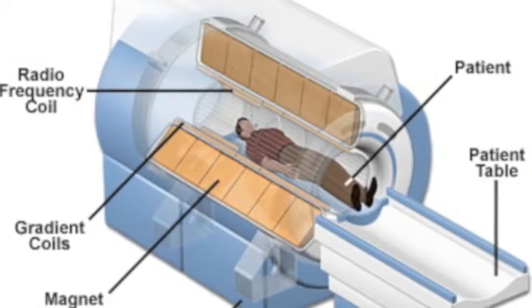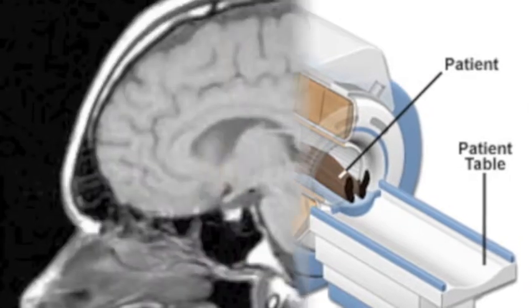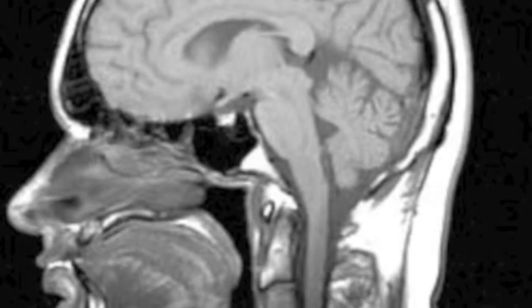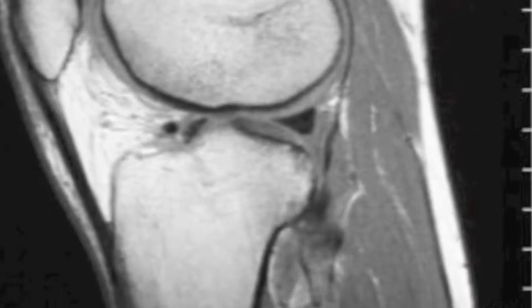This relatively new technology was founded in the year 1946 by Felix Bloch and Edward Purcell. Up until recently, MRIs were only used for chemical and physical analysis. It wasn't until 1977 that scientists began to develop MRIs into the technology we know today. It is important to understand MRIs because they are now used in many hospitals and facilities all over the world. Medical research is able to be done through 3D imaging, allowing doctors to visually analyze a patient's internal injuries without performing surgeries.